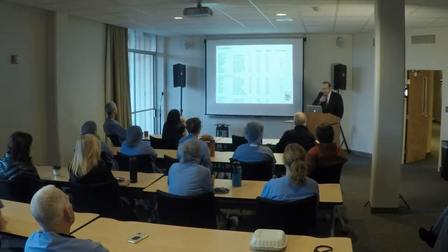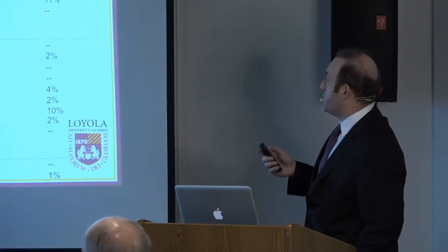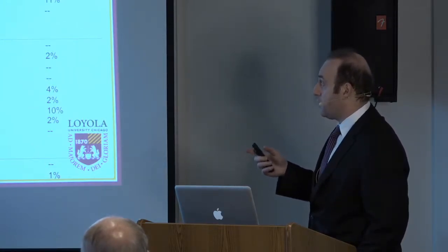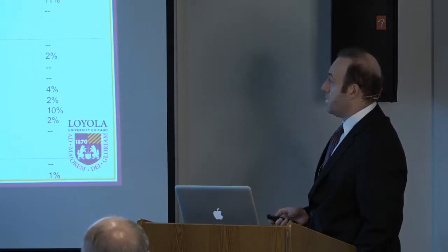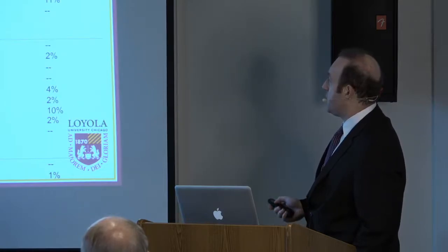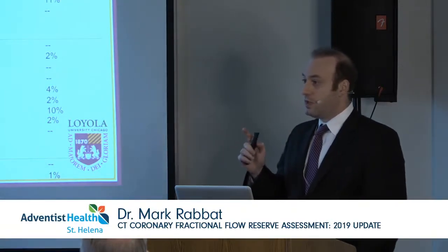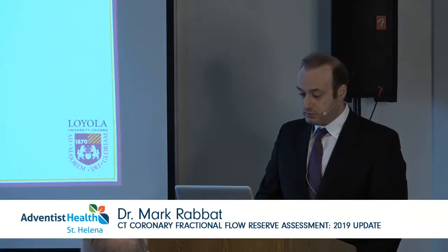So how good are we at identifying obstructive coronary artery disease using CT? Well, the sensitivities and specificities are quite high, and this is irrespective of the hardware utilized. So in the early days, using 64 slice scanners, now we have dual source CT scanners, 320 row scanners. All the data would suggest that the sensitivities are in the 90+% with a high specificity, 90+%. And this is comparing anatomic stenosis to anatomic stenosis. So CT stenosis greater than 50% to a cath stenosis greater than 50%.